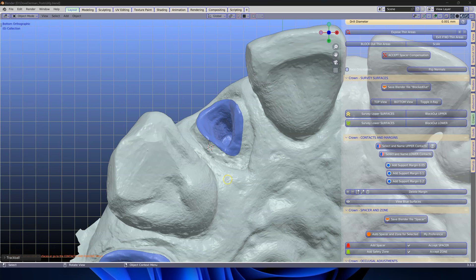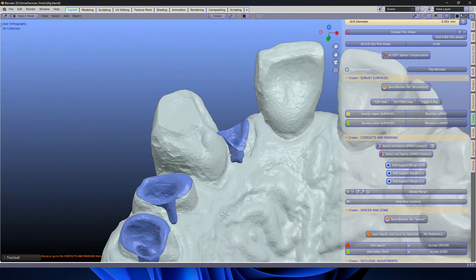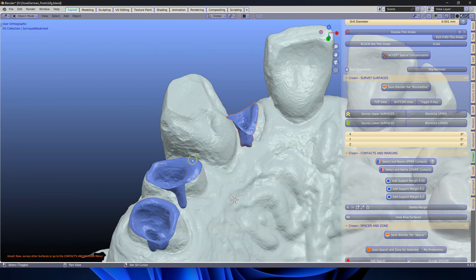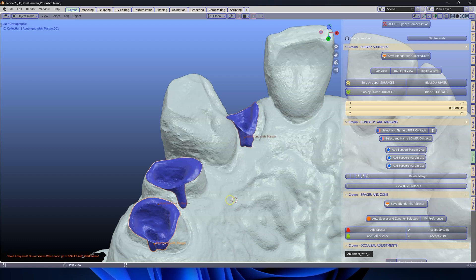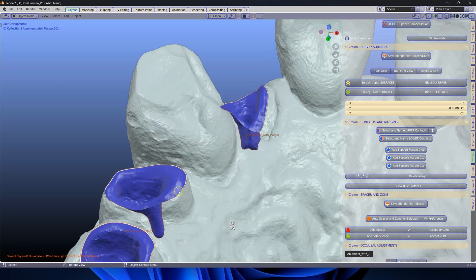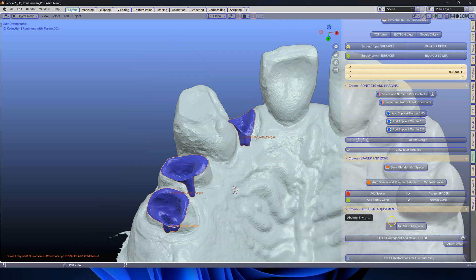Next we're going to go to the margins. Select all three of them. I'm going to give a miniature 50 micron margin. Then we're going to select all of these again and click on auto space zone.